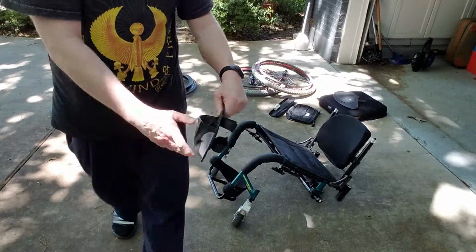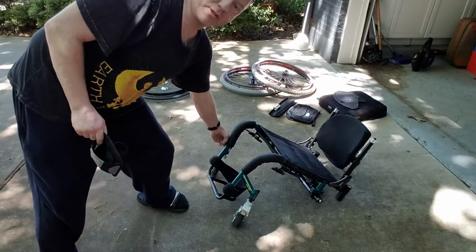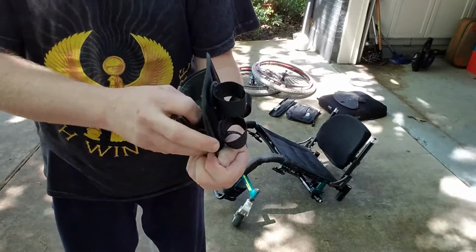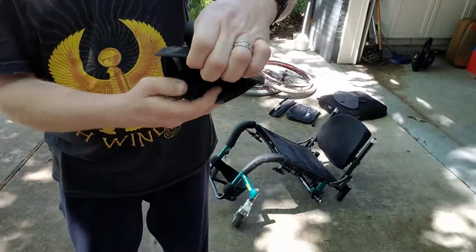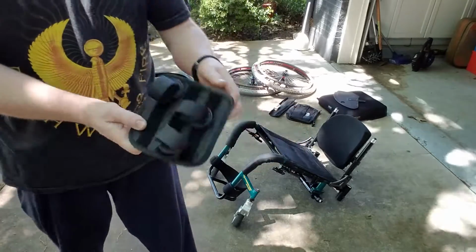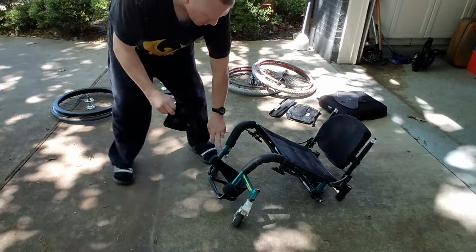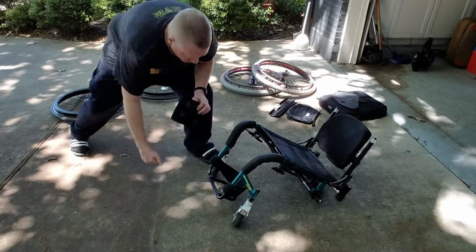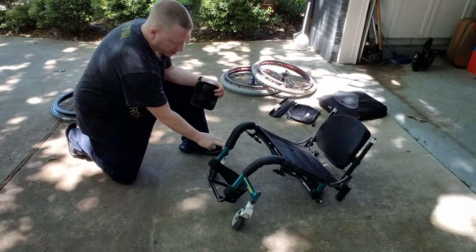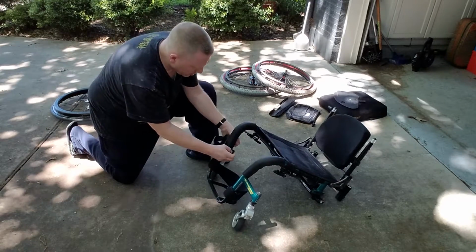Now this is just a little thing that you can attach. It attaches down here to the leg of the wheelchair, and you can put pens or a phone maybe in there. It's got some slots for things. You can kind of subdivide it. This can go back and forth if you want to create some spaces inside. On the back, it's got these three Velcro loops that line up with three parts of the frame right here. Essentially, these two right here go on this part of the frame, and then this one wraps around on the part that attaches to the wheel. And again, this is another piece that you never really need to take off once it's attached.